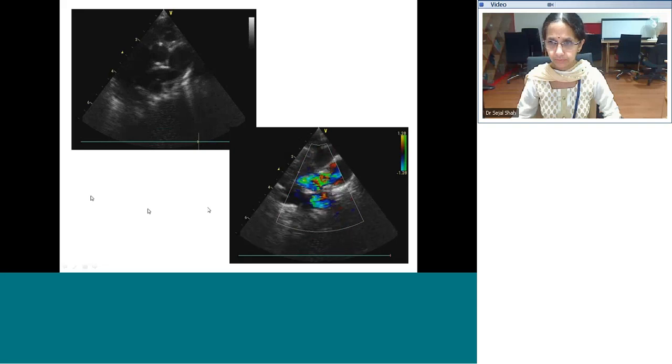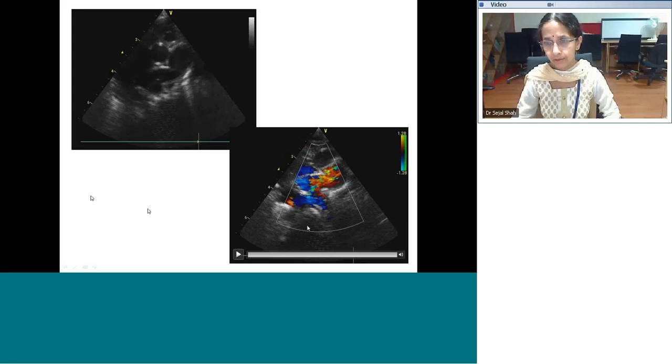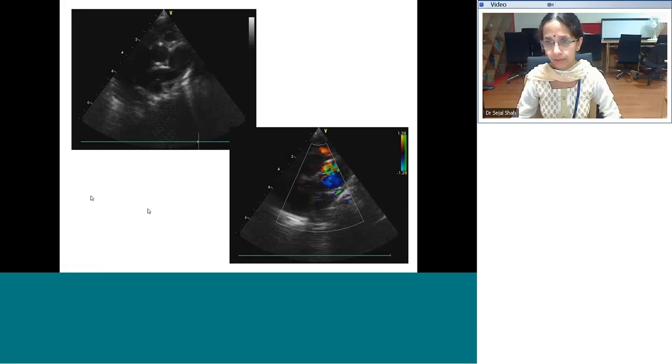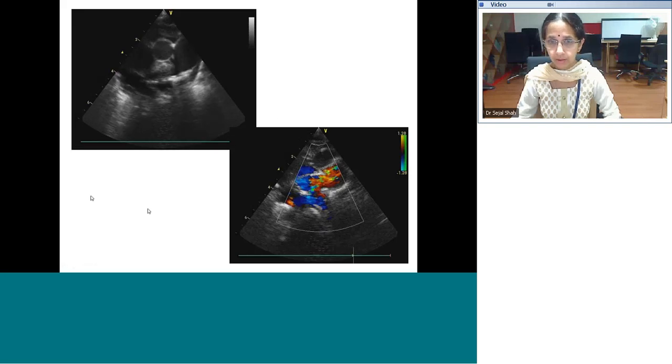Yes, parasternal short axis, and you feel there is a dilated PA? Akshata, which pulmonary artery do you think is dilated? The main pulmonary artery, the MPA. Okay. Anything further after the MPA that you think is not the usual one? No proper branching. That's right. So no proper branching in the sense we think the branches are not there, or the branching is not the usual way.